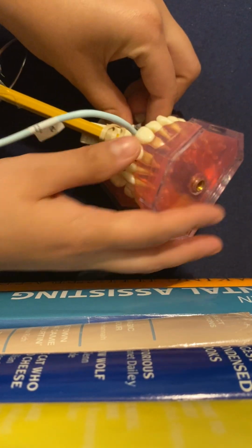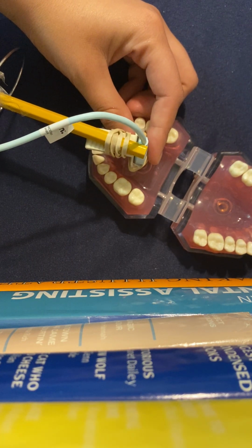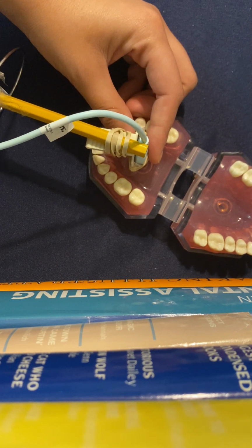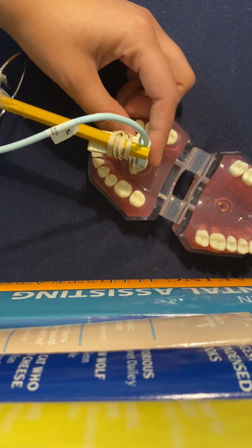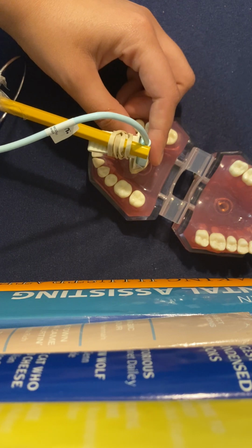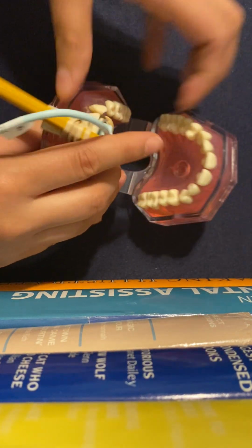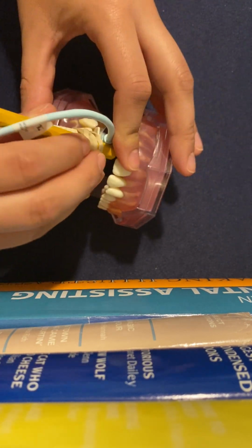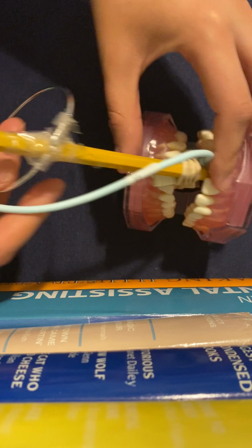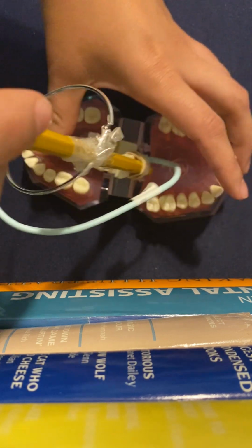Okay, so on this one, you're going to want to center with the central incisor contact point. And the teeth you're going to want to see are the mesial and distal of the central incisors and the mesial of the lateral incisor and apices. So you're going to have them bite down. Normally in real life, this would not take out their teeth. So definitely, this would be very center-wise.